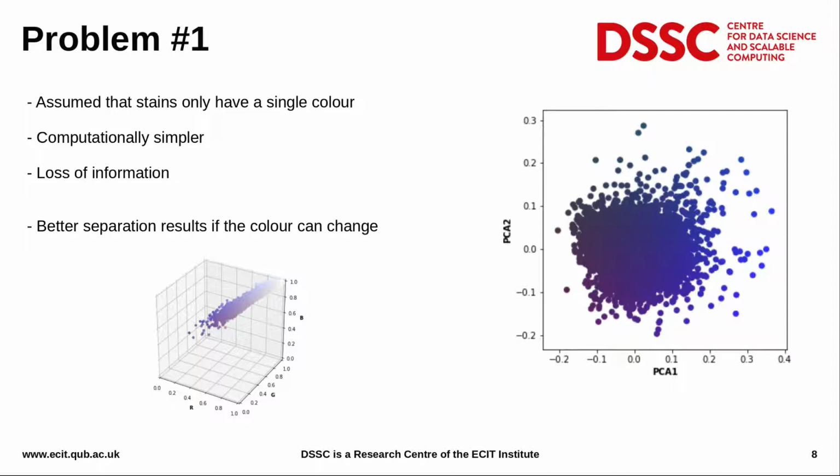It can be seen that hematoxylin can be expressed in a variety of colors from deep purple to rich blue. If we can include contextual information to better understand the kind of tissue at each spatial location in an image, better stain separation results can be achieved by modeling tissue-stain relationships.